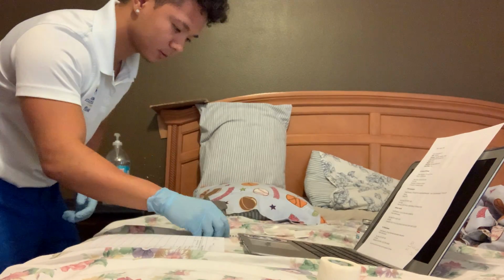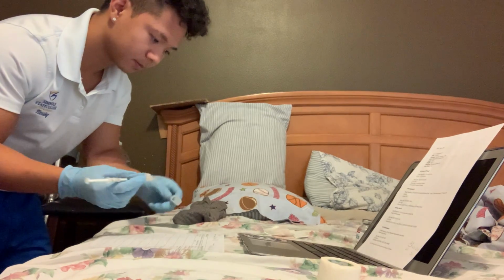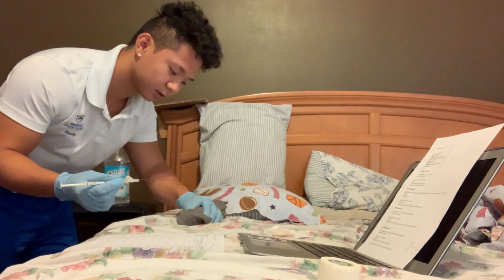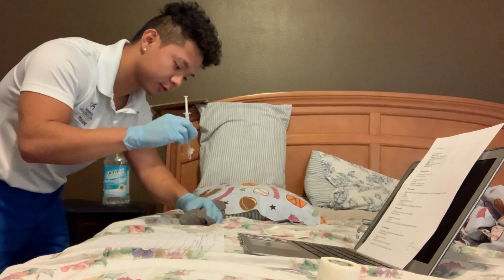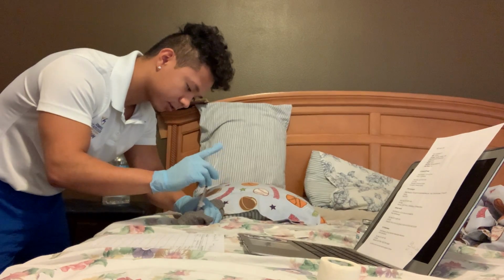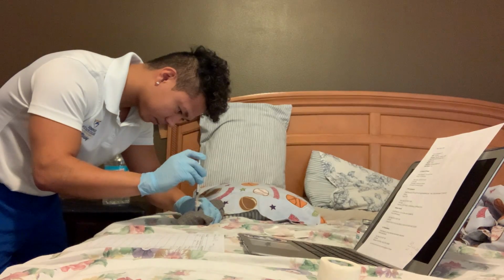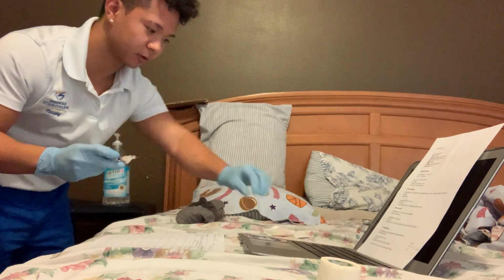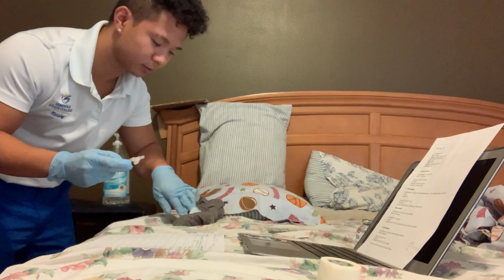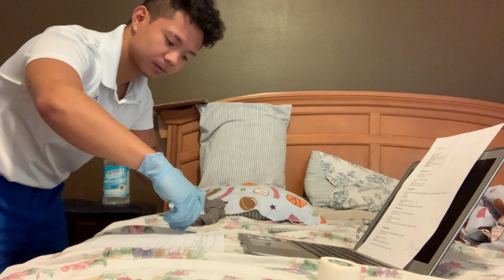And afterwards, I'm going to uncap and I'm going to pinch using my non-dominant hand. I'm gonna insert the needle at a 90-degree angle. I'm gonna slowly administer the medication. I'm going to use the gauze to hold pressure, and I'm gonna engage the safety on the needle. The safety would be on.